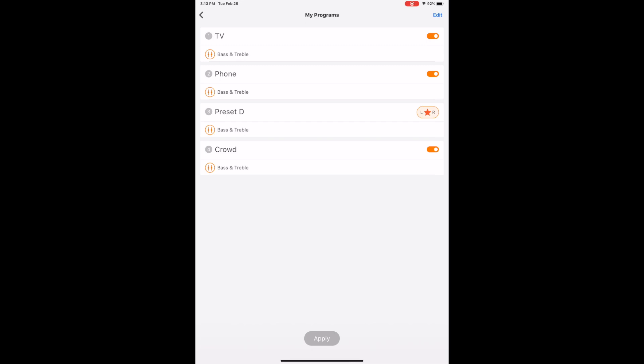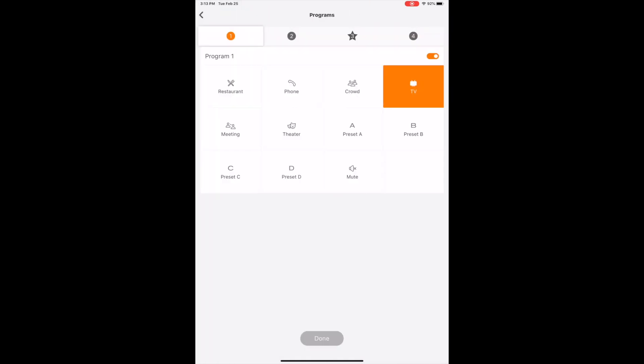And what it does, it gives you the ability to go in. Let's say we want to change program one. It gives you some preset or pre-configured situations like restaurant, phone, crowd, TV, meeting, theater, etc. You can also even set it on mute.